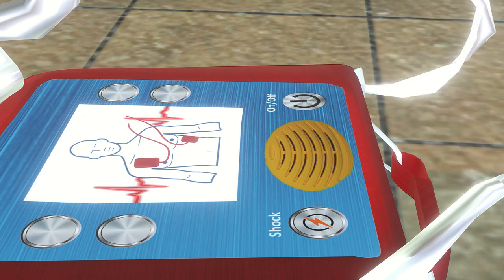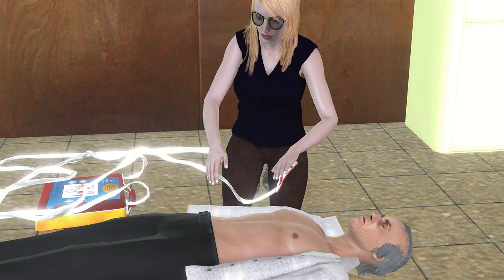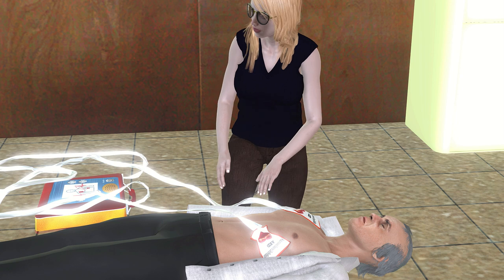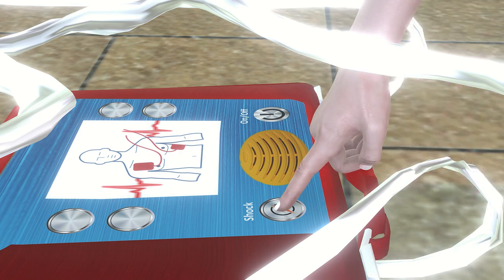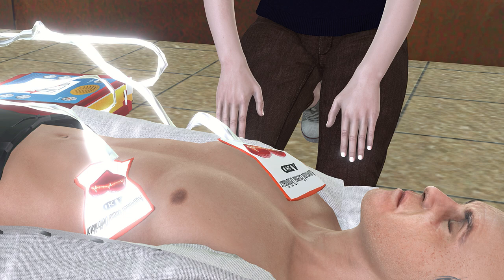Unit turned on. Stay calm. Check responsiveness. Call for help. Attach defibrillator pads to patient's chest. Don't touch patient. Analyzing. Don't touch patient. Analyzing. Shock advised. Don't touch patient. Press shock button. Shock delivered. Start CPR.